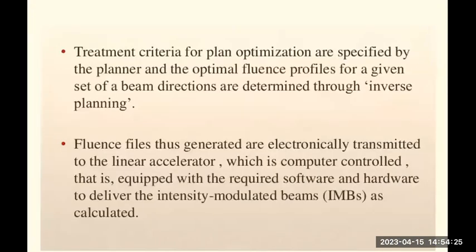The treatment criteria mainly focus on how to optimize the intensity level, by which the dose distribution has to be properly monitored based on the strength of the tumor. These fluence files, the intensity files, decide which beam is to be applied on which area. This is computer controlled and given to the LA, the linear accelerator. In a few books, linear accelerators are shortened as LINAC; in a few books, as LA.